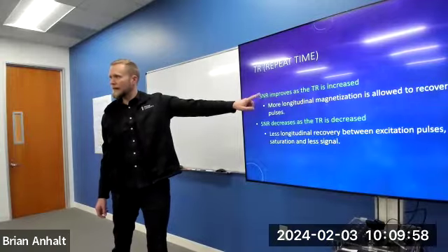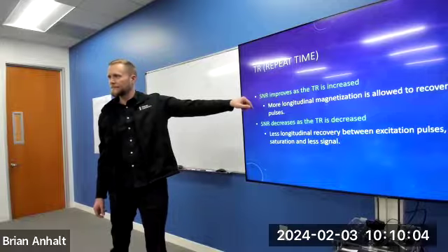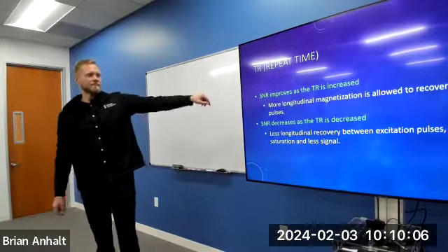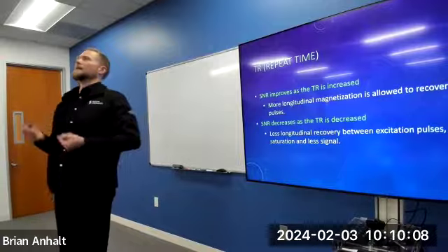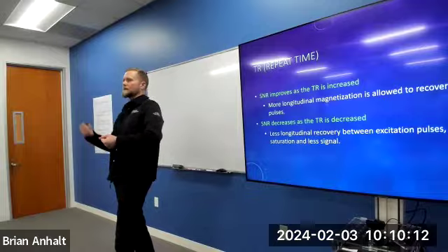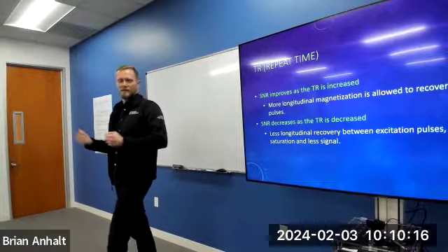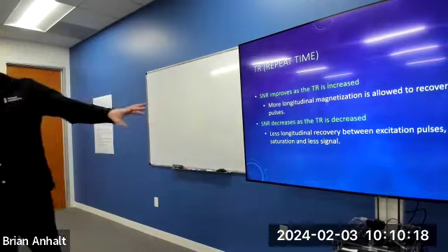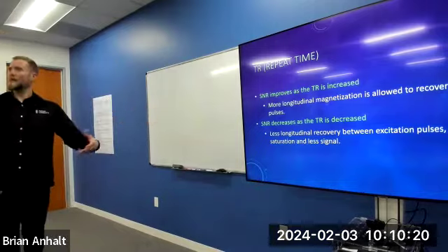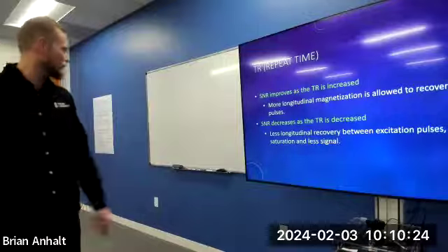So you are already sacrificing SNR to get T1 weighting. Following me? I think a lot of people get confused. It's like, well, why would you want to do that? Because you're getting worse SNR. It's like, no, I'm sacrificing it for something else, right? It's a trade-off. Doesn't mean our SNR is going to look bad. Just means that we have to do other things to get more signal back or lower more noise so that we can get a good looking image.